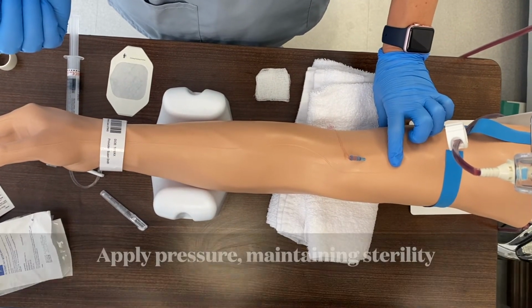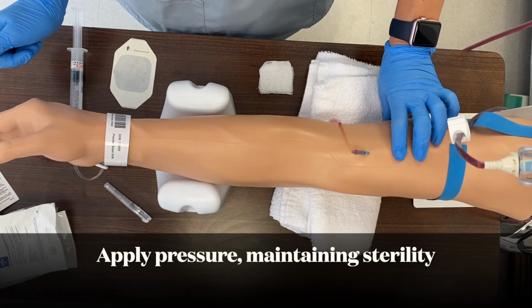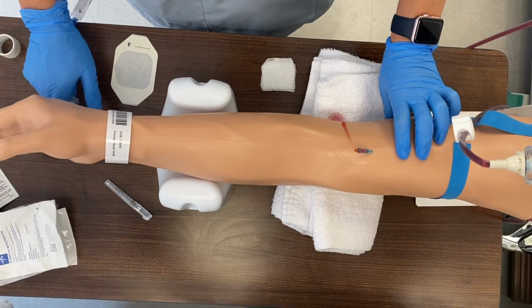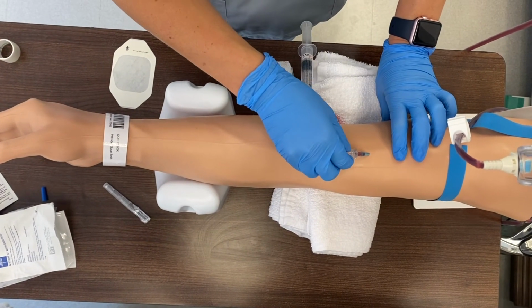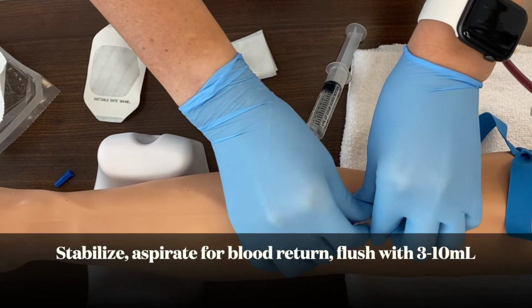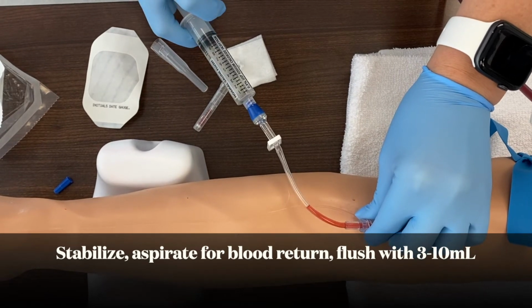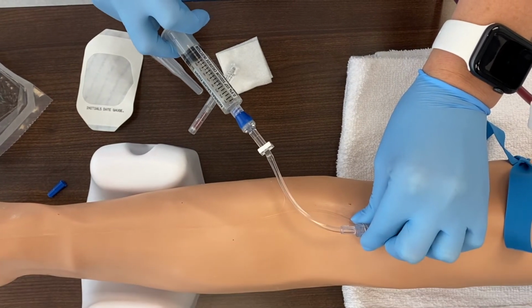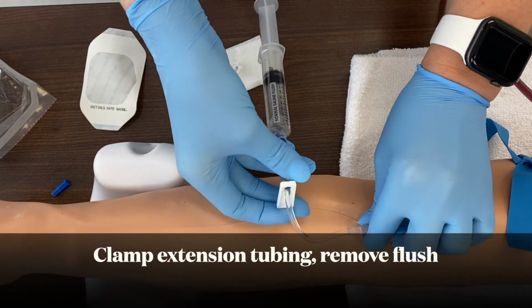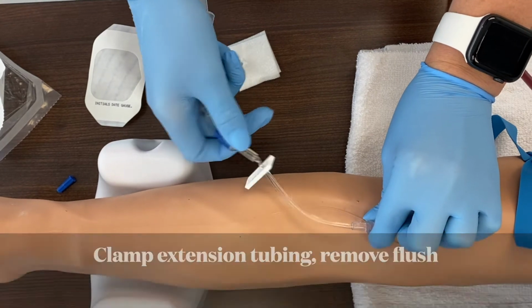Release tourniquet and apply slight pressure above insertion site while attaching extension tubing to catheter, maintaining extension tip sterility. Stabilize catheter. Aspirate slightly for blood return and flush gently with 3 to 10 milliliters of saline, observing the site for infiltration and leaking. Then clamp extension tubing and remove flush syringe.